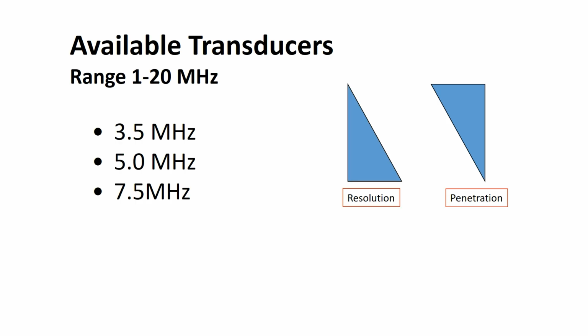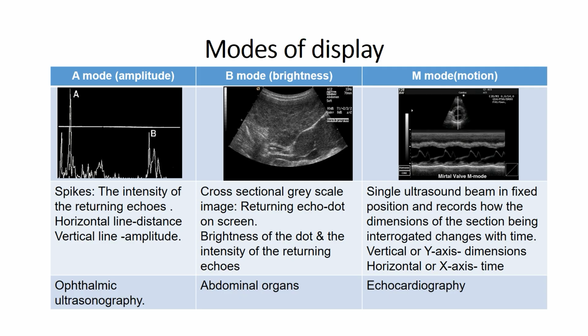If the megahertz is increasing, the resolution is increasing. If the megahertz is decreasing, the penetration power is increasing. So, this is about the available transducers. Now, let us discuss the modes of display.